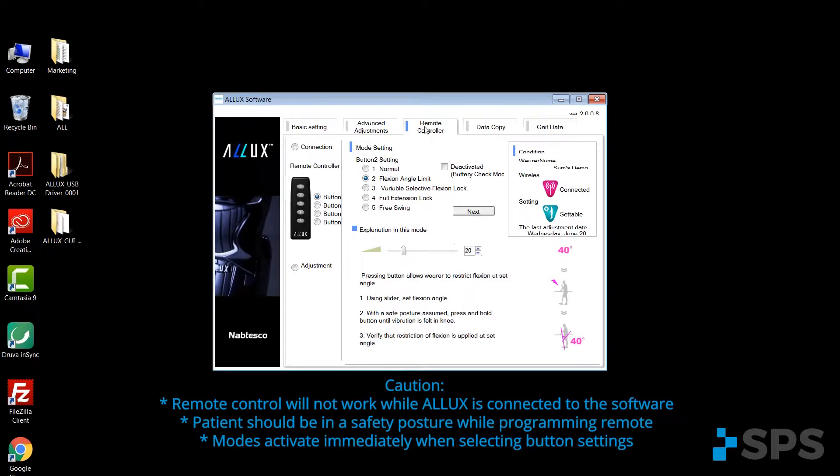While setting up the remote, on the left side you'll notice that there's buttons two, three, and four that you would select. Select a button and then select on the right side which feature or which setting you would like to be assigned to that button.